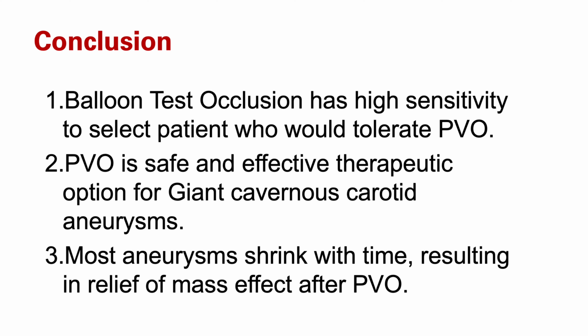So in conclusion, balloon test occlusion has high sensitivity to select patients who would tolerate the parent vessel occlusion. Parent vessel occlusion is a safe, effective therapeutic option for giant cavernous carotid aneurysms. Most aneurysms shrink with time, resulting in relief of mass effect after the parent vessel occlusion.